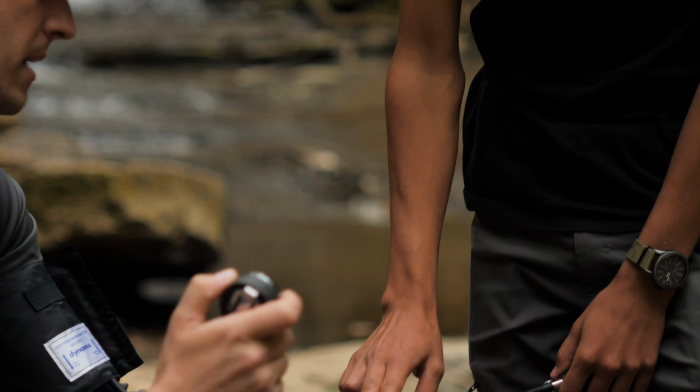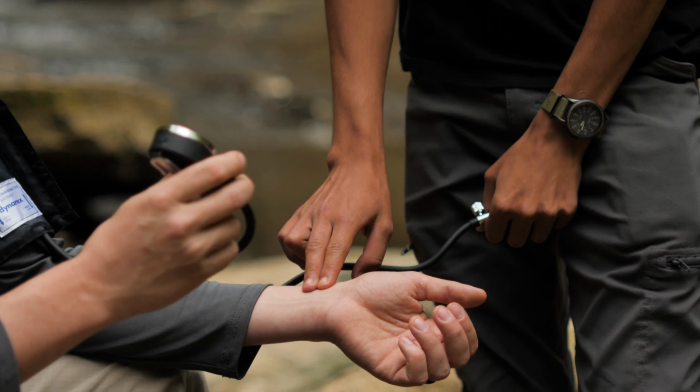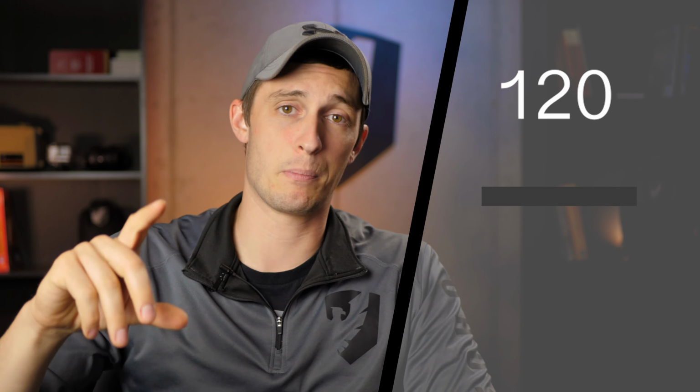So the second method we can use to obtain a blood pressure is the palpated method. So what this is, you are palpating a pulse with your fingers. You're going to pump the blood pressure cuff up until that pulse disappears. You're going to crack the valve open and you're going to watch that needle as it goes down. And as soon as you feel that pulse again, that's your top number. That's your systolic. There's no way to get a bottom number or a diastolic number off of this. So you just go down, you feel it, that's your top number, and the way you'll write this is your top number with a line and then a P underneath.